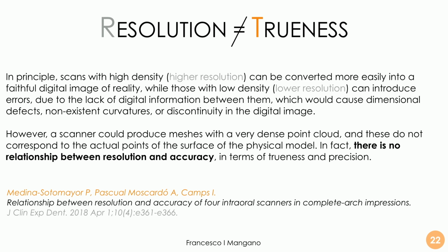A scanner could produce meshes with a very dense point cloud, and these do not necessarily correspond to the actual points of the surface of the physical model. In fact, there is no relationship between resolution of acquisition and accuracy. Accuracy in terms of trueness and precision.